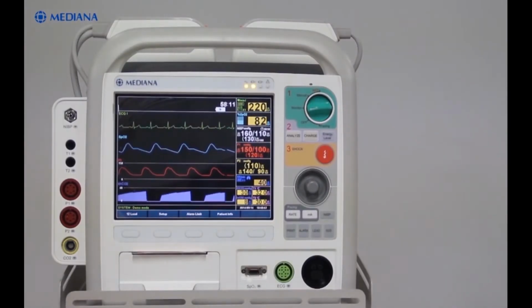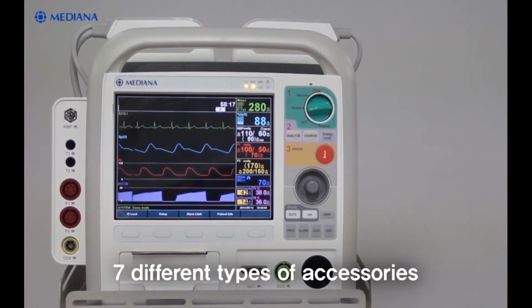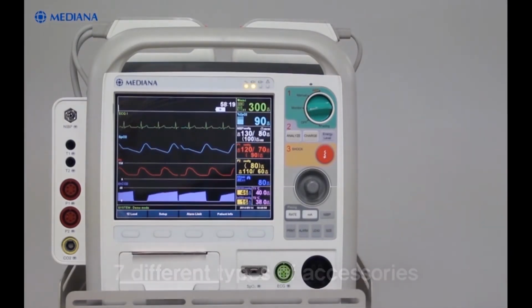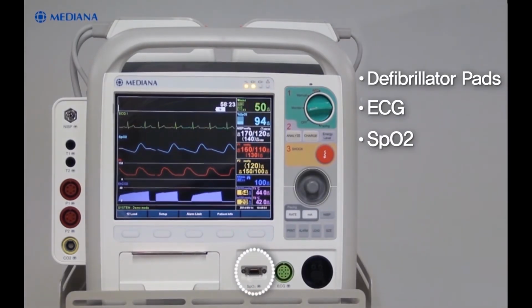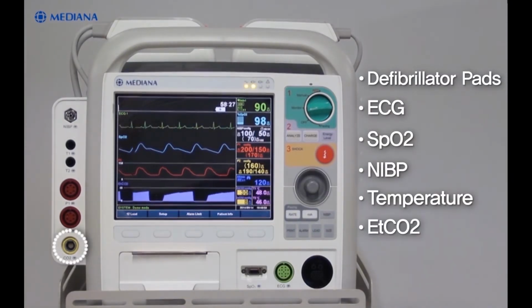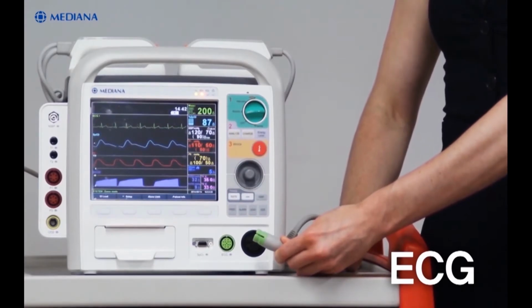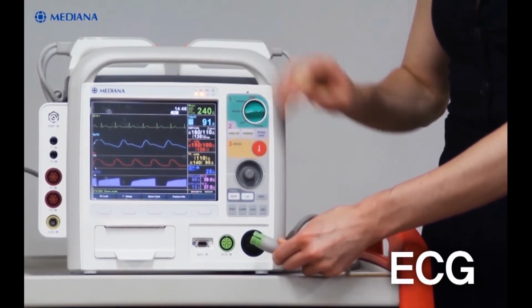Let's see how to use the accessories for the different parameters. We have 7 different types of accessories for the different parameters: defibrillation pads, ECG, SpO2, NIBP, temperature, EtCO2, and IBP. First of all, for the ECG, all you have to do is connect the ECG cable to the ECG connector.